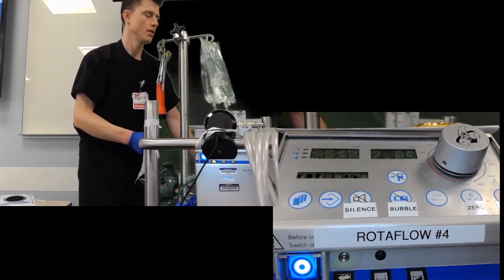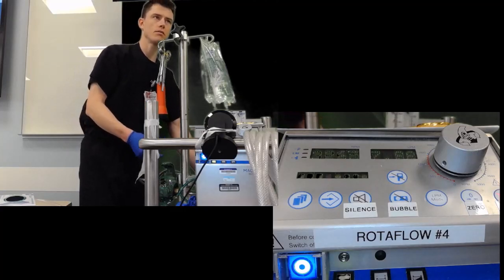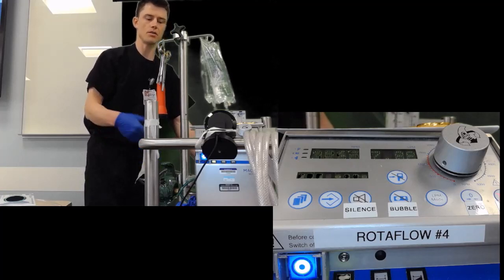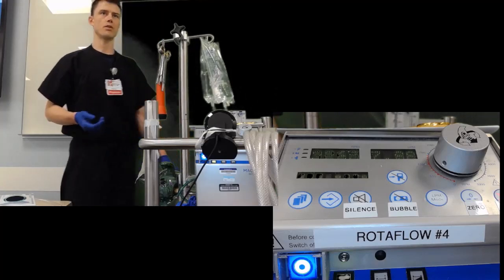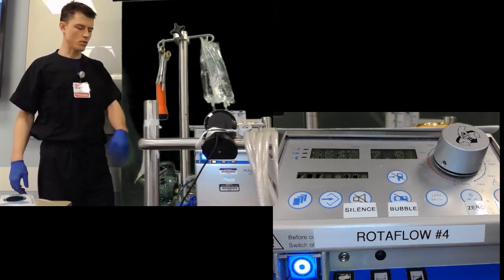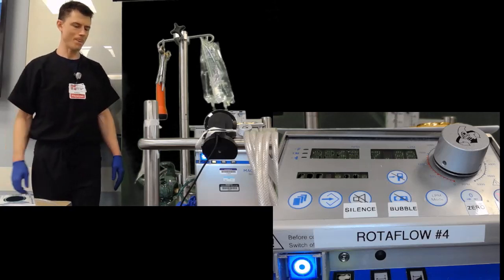Okay, gotcha. Another scenario is that you just came back from CT scan, and now the patient is not oxygenating well. And so let's say we're not hooked up to the wall. What else could we be hooked up for gas? Tanks. A tank, okay? So let's say we want to be hooked up to the tank. You want to troubleshoot that for us?